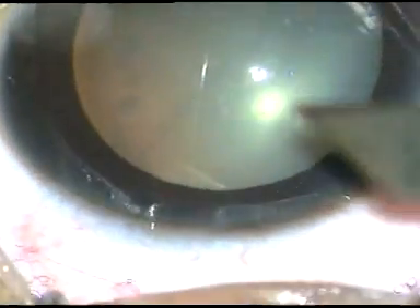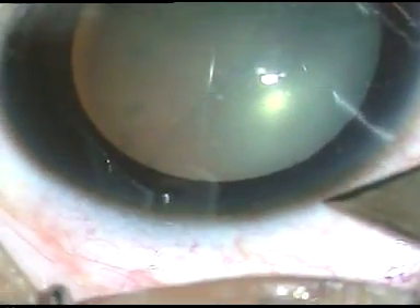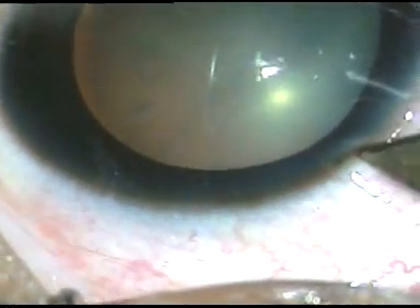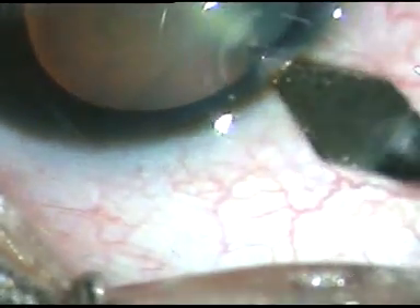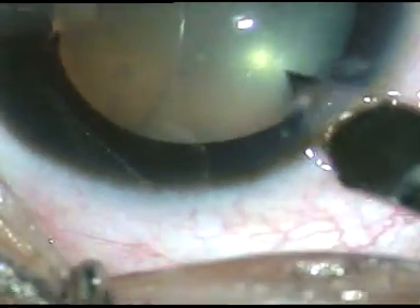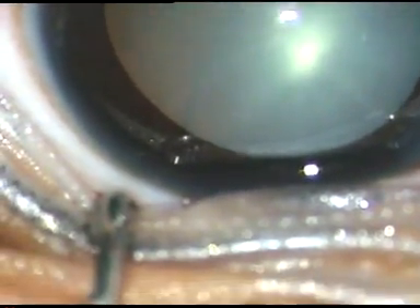Dear colleagues, this is a traumatic cataract. You can see there is a rupture of the posterior capsule in this case, and it is because of blunt trauma. I have taken up this case for surgery. Let us see the surgical steps.